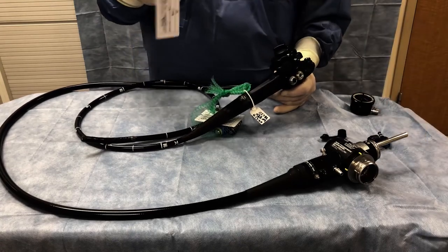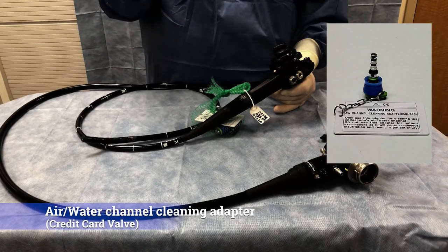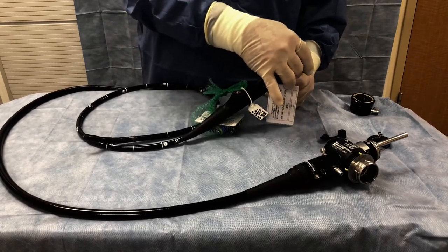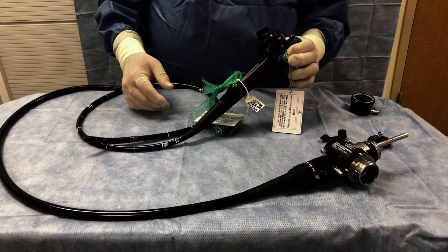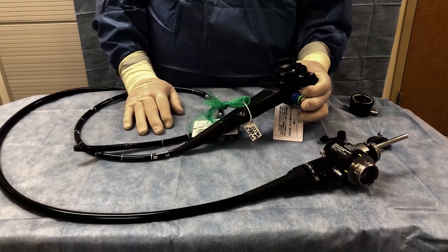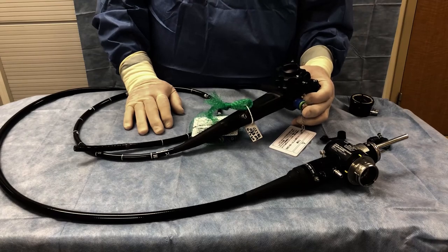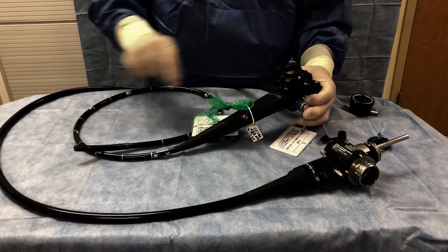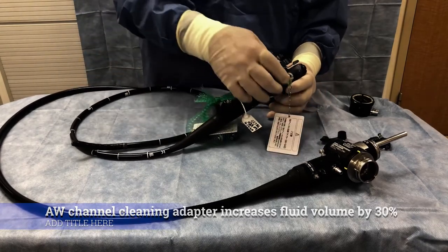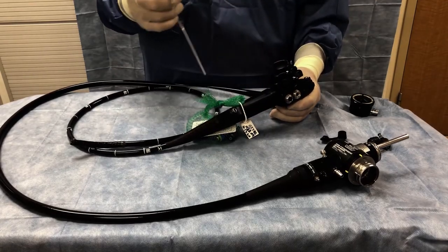This is called a credit card valve — it is blue, and it is nicknamed that simply because it looks like it is attached to a credit card. When we are cleaning the scope, it goes into the air-water valve port along with the suction valve. It enables a 30% increase in the amount of fluid that can be sucked through the scope, so we use it when sucking detergent through the scope before it goes into the manual cleaning mode.